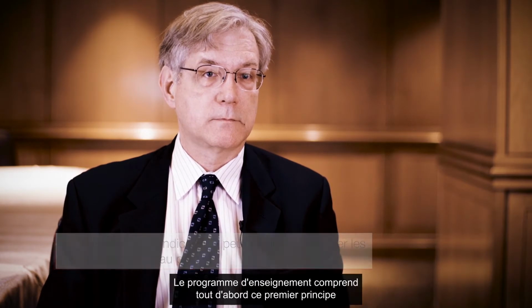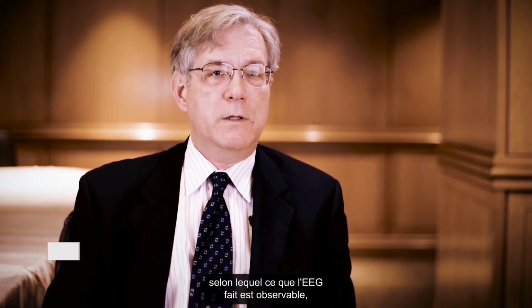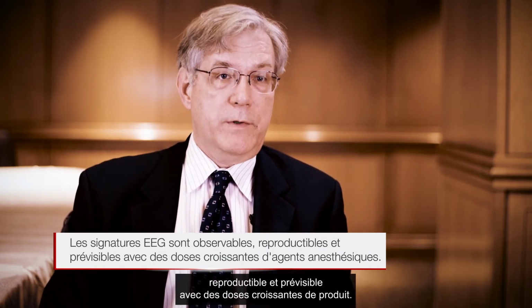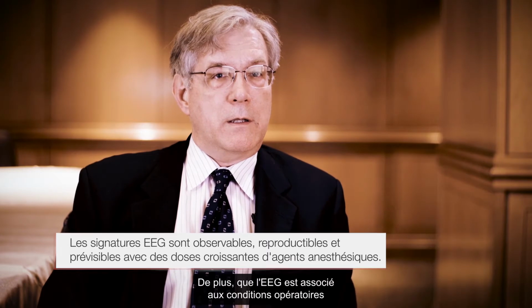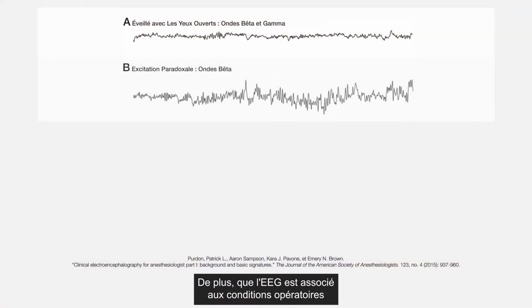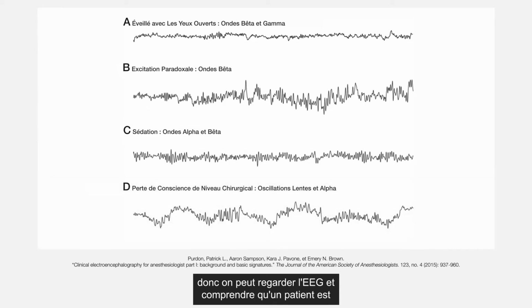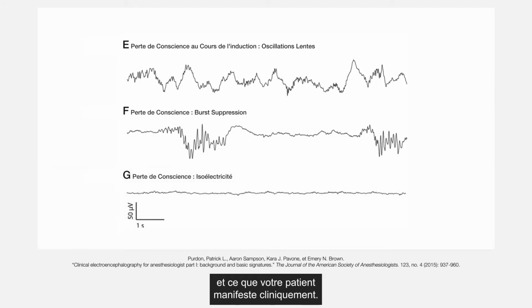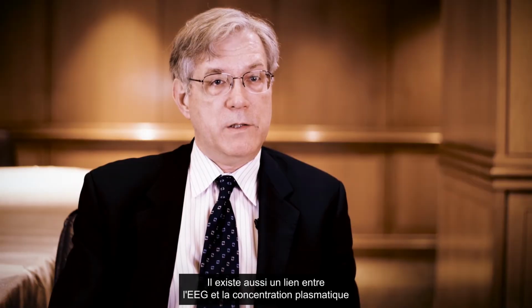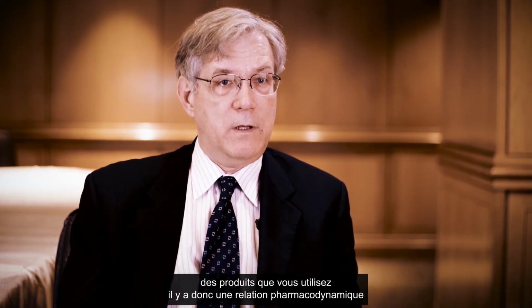The teaching program involves, first of all, that first principle, that what the EEG is doing is observable, reproducible, and predictable with increasing doses of agent. Also that the EEG is associated with surgical conditions. So you can look at the EEG and understand that a patient is ready for a general anesthetic or is in a plane of sedation, so that there's a connection between what you're seeing with your EEG and what your patient is demonstrating clinically. There's also a connection between the EEG and the actual plasma level or drug level of the agents that you're using.